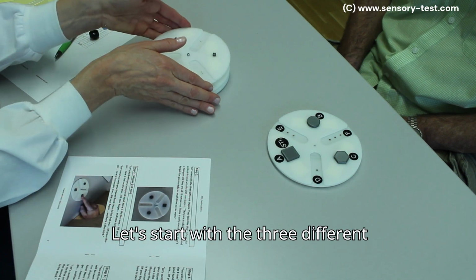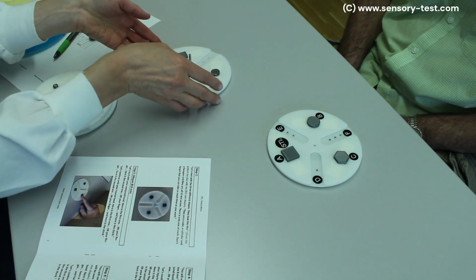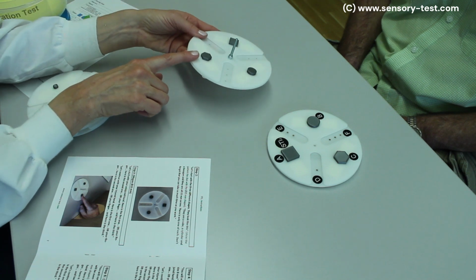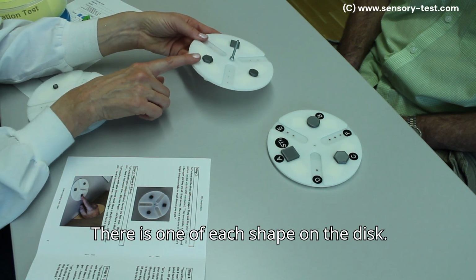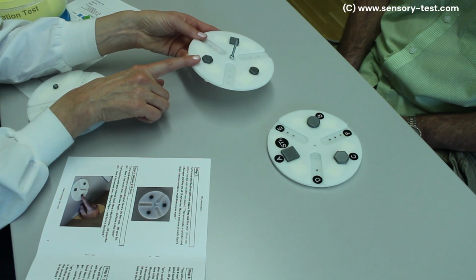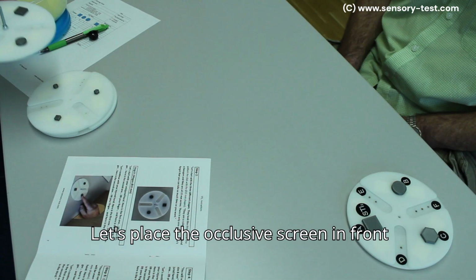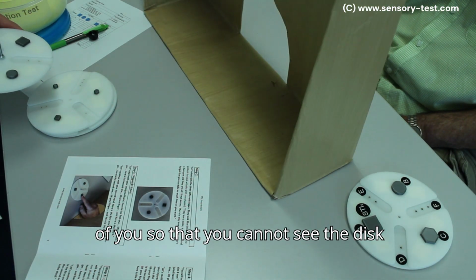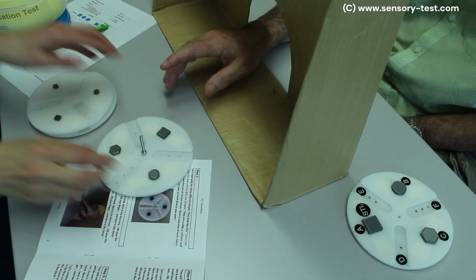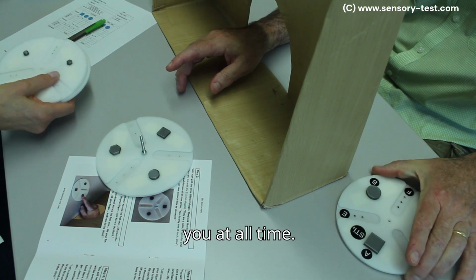Let's start with the 3 different shapes. They look like this. There is one of each shape on the disc. Also, don't forget that you can take as much time as you want. Let's place the occlusive screen in front of you, so that you cannot see the disc while you are performing the test. The template disc will remain close to you at all time.